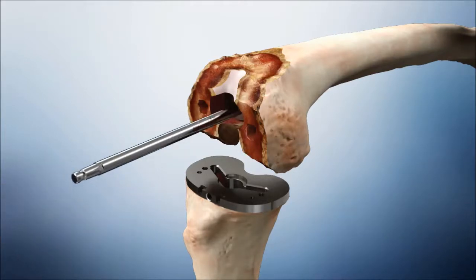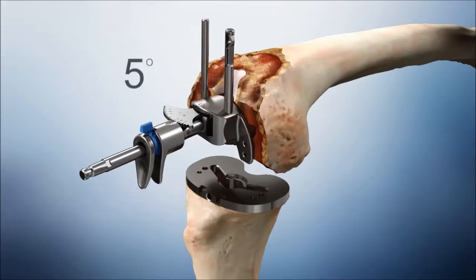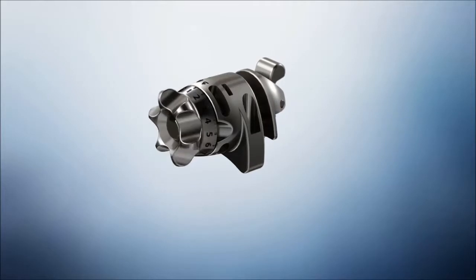Assemble the removable shaft into the broach. Slide the distal femoral alignment guide over the removable shaft. Set the valgus angle to 5 degrees left or right, respectively, and turn the blue tab to lock the setting. Assemble the distal femoral connector to the distal femoral resection guide by turning the dial from the padlock symbol clockwise to the number of the planned level of resection.